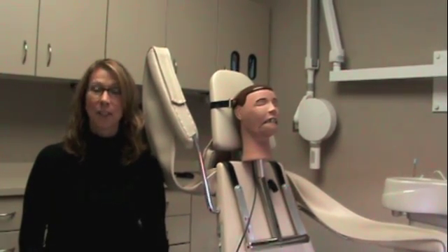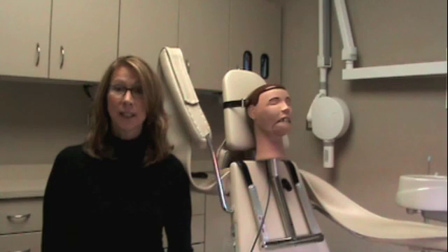Congratulations on your recent Dexter purchase from Dentsply RIN. Please refer to your directions for use in the packaging.